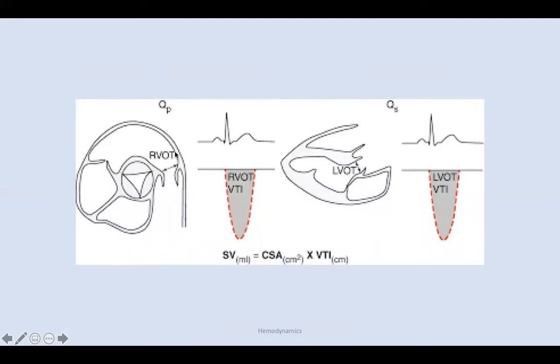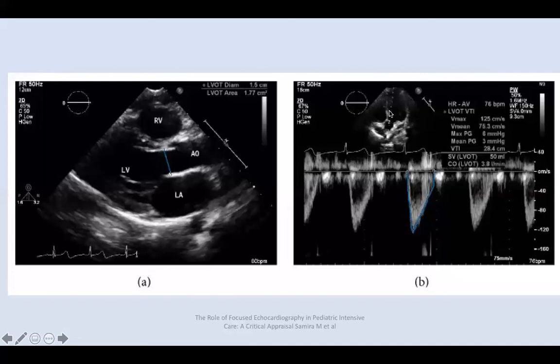We will speak again about how to measure the RVOT diameter — short axis view just below the pulmonary valve. LVOT diameter — long axis view just below the aortic valve. And VTI in the five-chamber view below the aortic valve using PW Doppler; then trace and you will get the VTI.